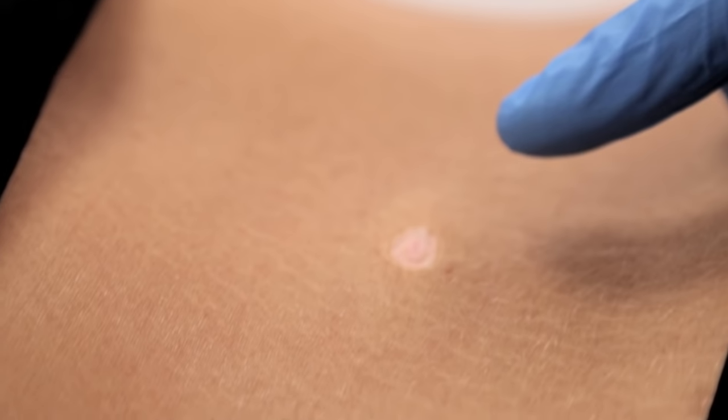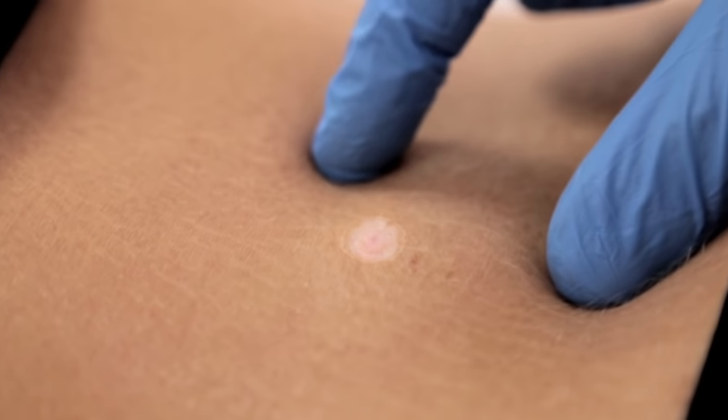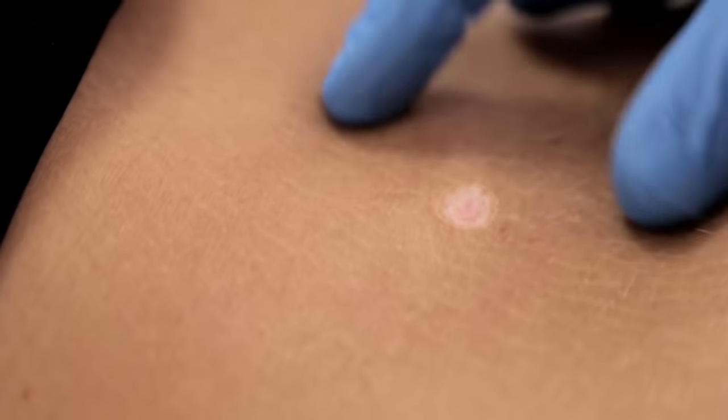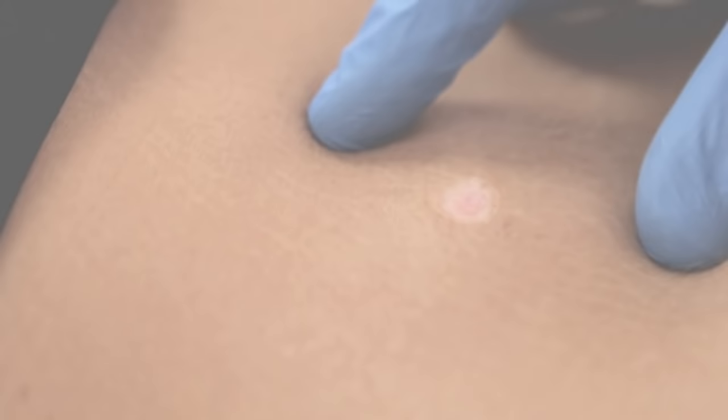As you can see, the mole's been fully removed. Now what we'll do is apply a dressing over the top and give some aftercare and also some written instructions. Over the next two days, we'll apply some clear ointment, which will just prevent the lesion forming a scab. Then a light scab will form over the next few days, which will fall off, leaving a pink mark which remains for approximately two weeks. Our nurses will review the mole just to make sure that it's healing as expected.